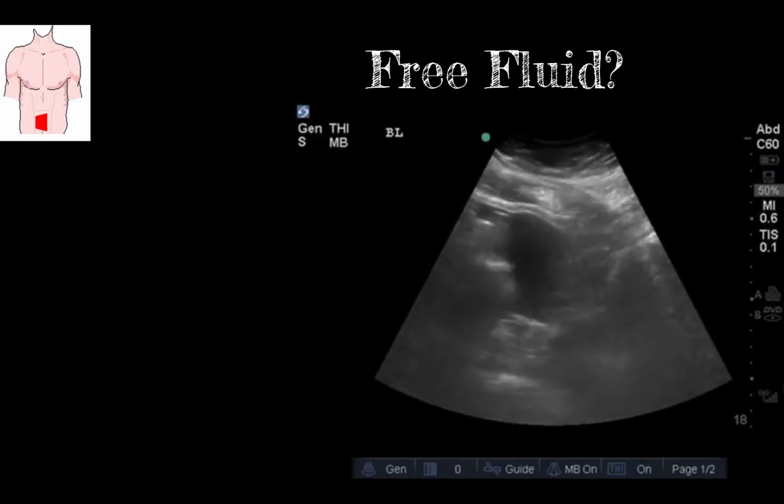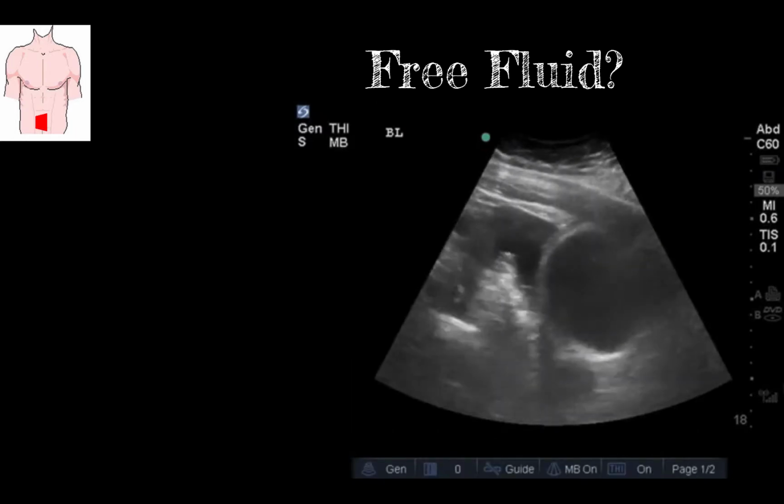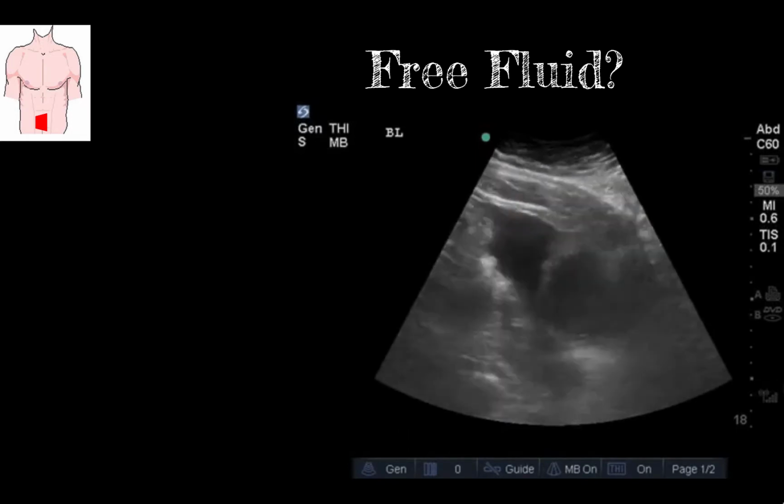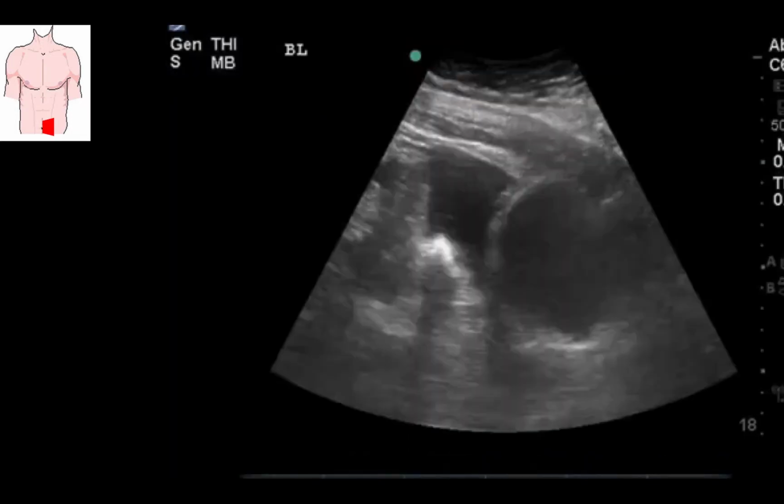However, on the same patient, when you turn the probe sagittally, you'll see what almost looks like a second bladder. Here it is a bit closer up. Green outlines the bladder itself, and blue is the free fluid. Note the irregular edges and finger-like projections in it. These finger-like projections are loops of bowel floating in free fluid.